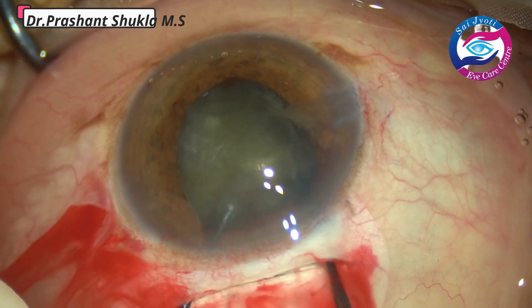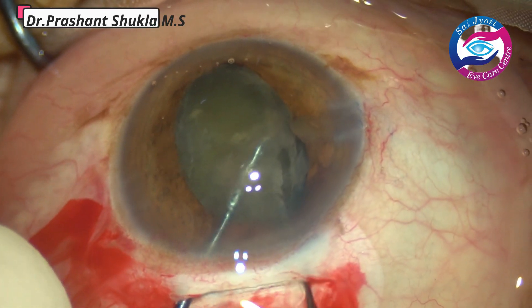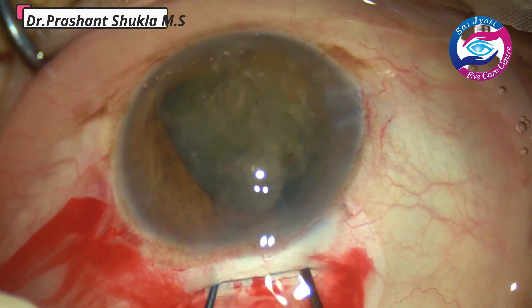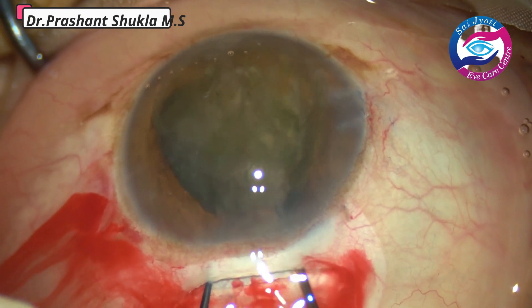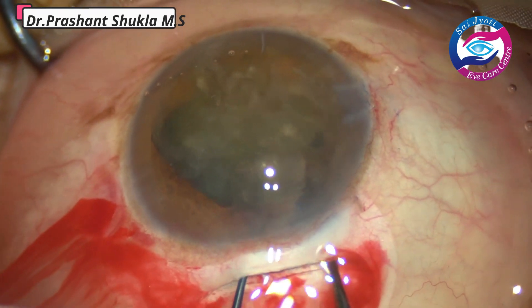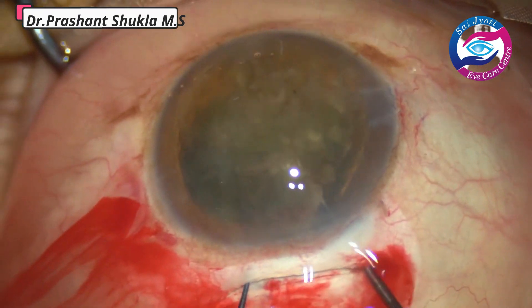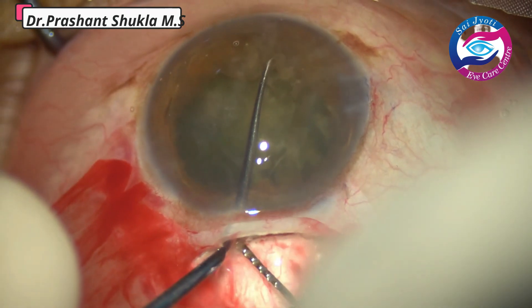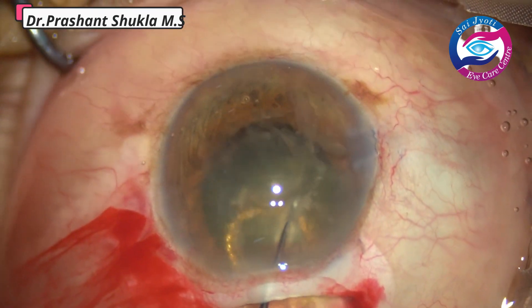This is another case demonstrating a bi-manual prolapse of the nucleus from the capsular bag through a small pupil. Two Sinski hooks are used to wheel out the nucleus out of the capsular bag and this is how the nucleus comes into the anterior chamber. The same phaco sandwich technique is then used to remove the nucleus.